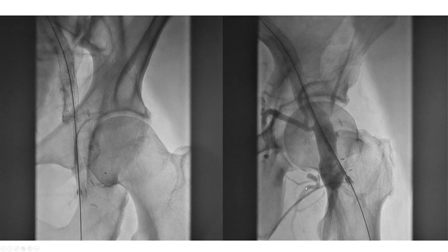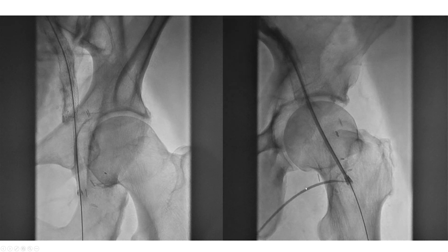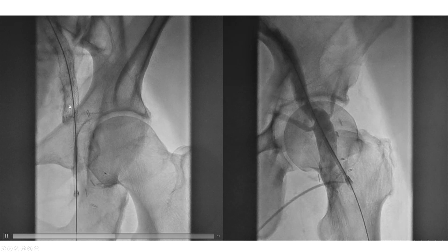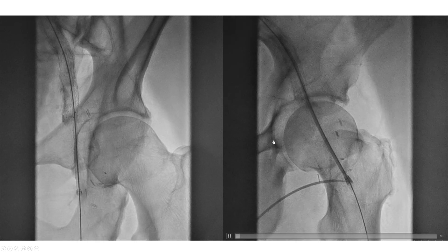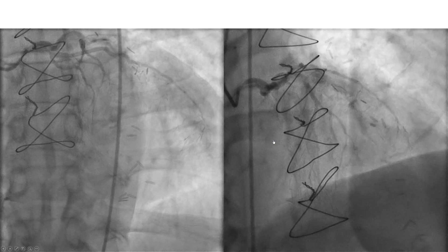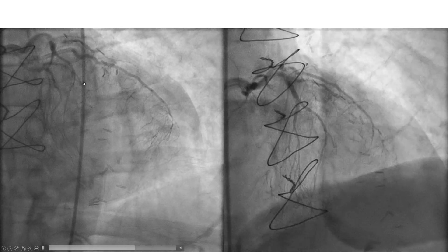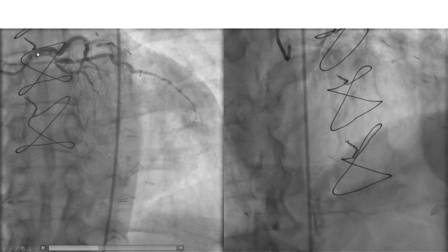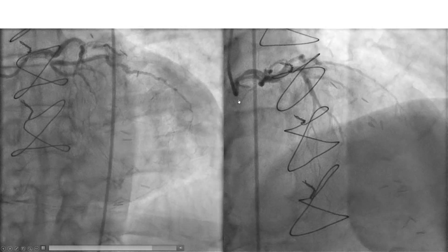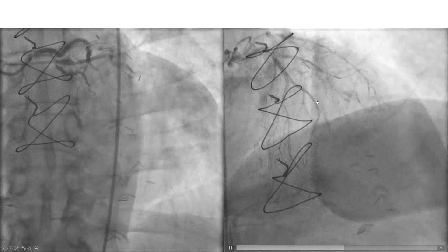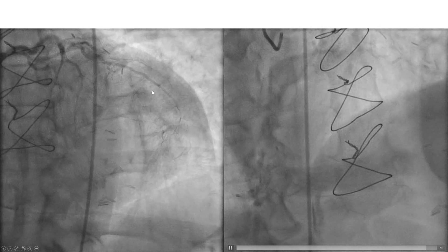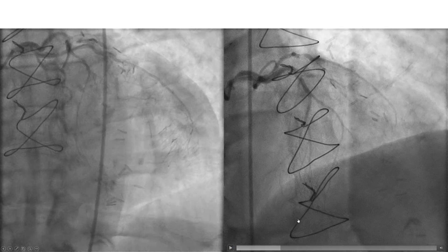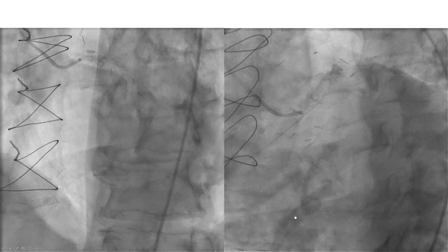Diagnostic angiogram was done using the left common femoral axis, which was fairly challenging to obtain. We can see there are old stents in the external iliac artery. Eventually angiogram was performed, demonstrating significant disease in the proximal circumflex as well as the proximal LAD. The LAD is occluded in the mid-segment; however, there is a large septal branch arising from the LAD supplying the PDA that appears to be occluded.